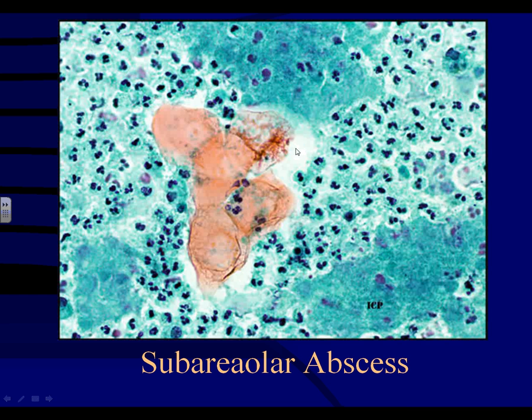This is from a subareolar abscess. These cells are anucleate squames — a very important clue to this lesion. These abscesses occur right beneath the areola. They show mixed inflammation with abundant neutrophils, and characteristically show anucleate squames because the areola is covered with stratified squamous epithelium. You don't see this in other types of abscesses. This type may need surgical debridement — it may not respond entirely to antibiotics.